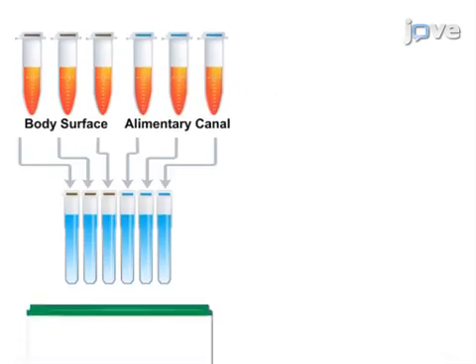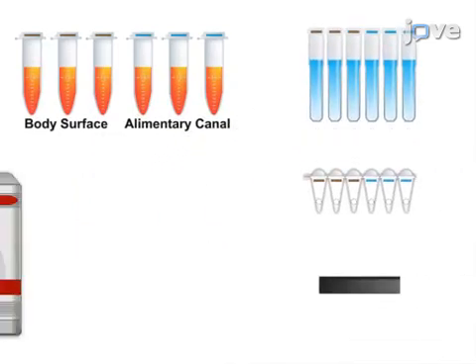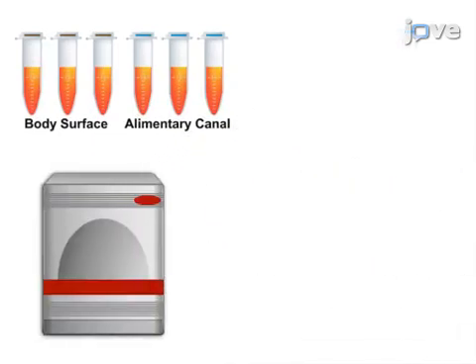Next, the enriched samples are lysed and added to PCR tubes containing ready-to-use tablets for PCR-based detection of the target pathogens.